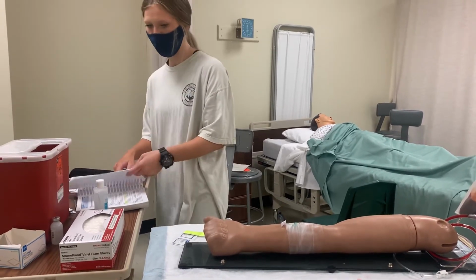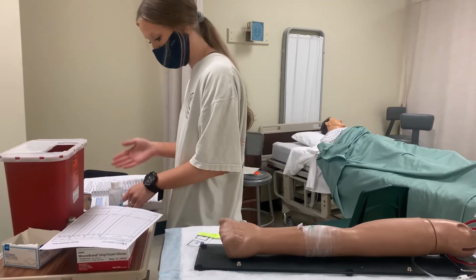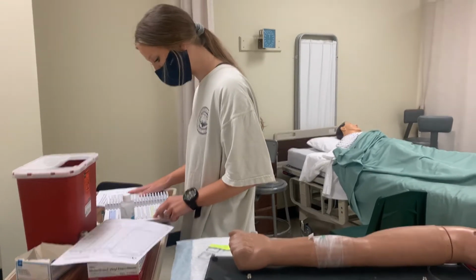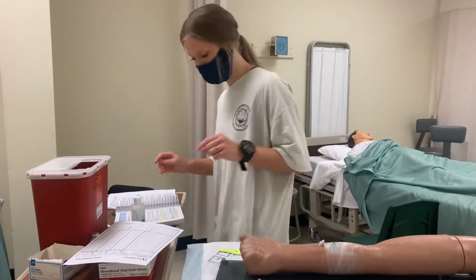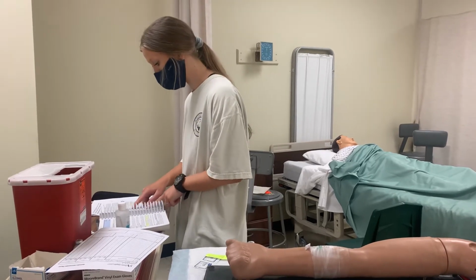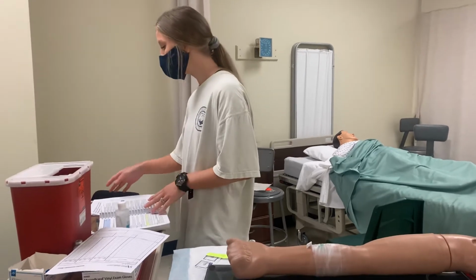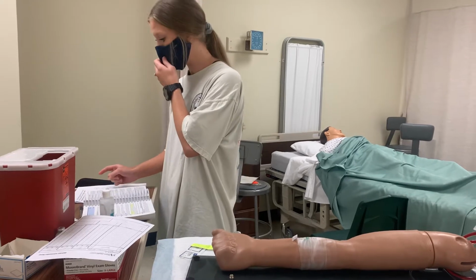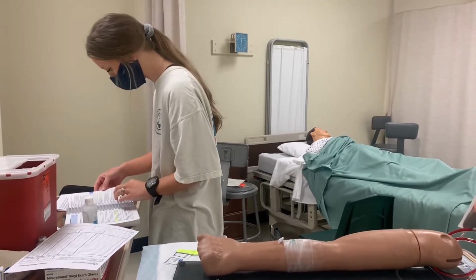Now I'm going to look in the book to see what a safe dose is. For edema, which is what we're giving it for, it is 20 to 40 milligrams, so we have a safe dose. It can be given undiluted, but it is compatible with the D5W, which is what we have running. For IV push, each 40 milligrams is given over 1 to 2 minutes. Since I'm given 20 milligrams, I'm going to give that over 1 minute. So I'm going to push 1 milliliter over 30 seconds, and then the other over another 30.